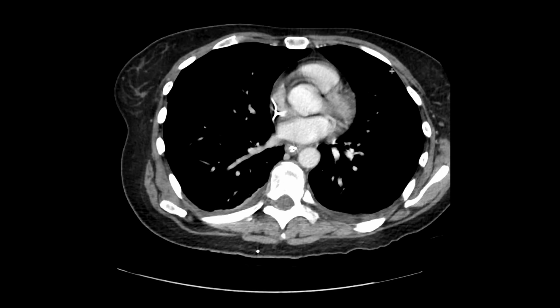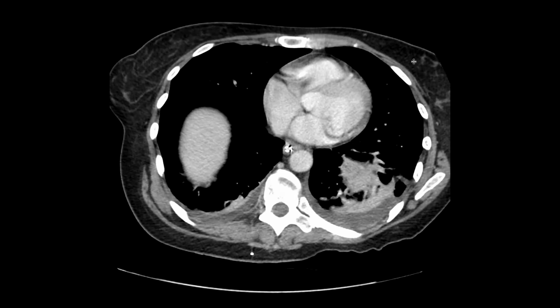But what happens to the other pieces of bowel? What used to be at the end of the stomach was the duodenum. Well, that's not completely removed, right? You have the gallbladder and the common duct and the pancreas with the pancreatic duct dumping digestive enzymes into bowel. It's supposed to be dumping it into the duodenum, so you can't just tie that off. You have to connect it up to a piece of bowel. So they left in a piece of the duodenum to drain those organs and help with digestion. Of course, you need that. And you're never going to see any of that on an upper GI.